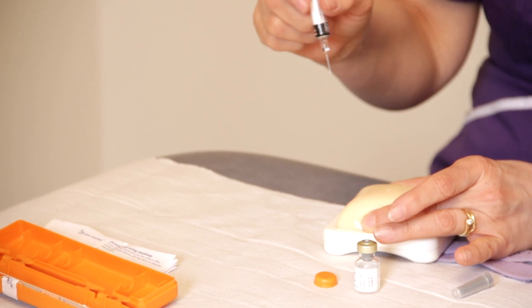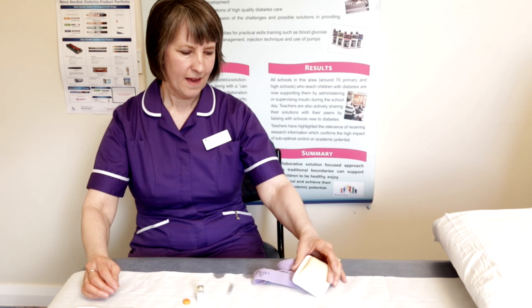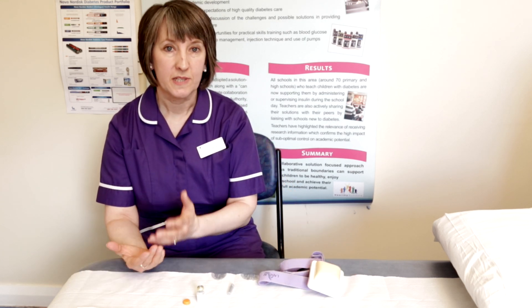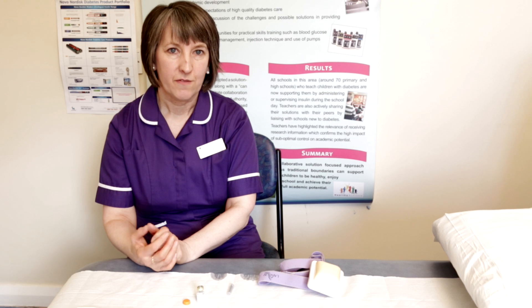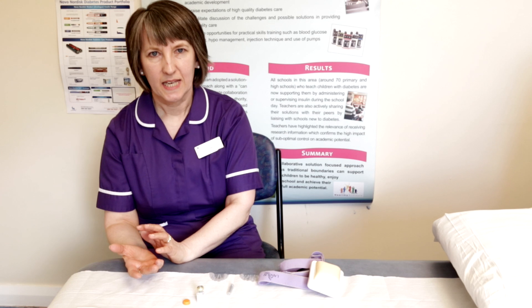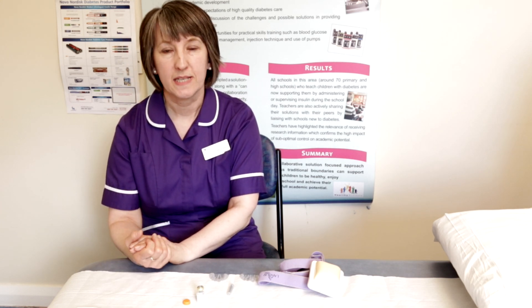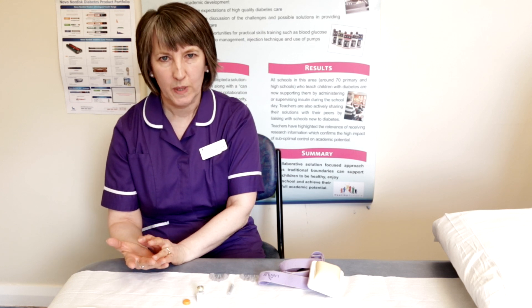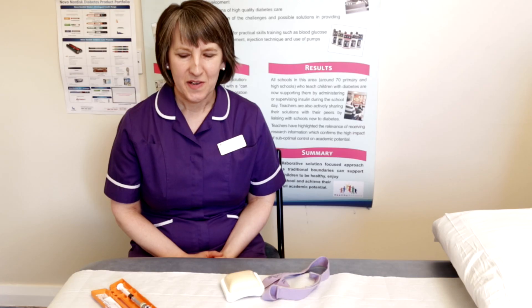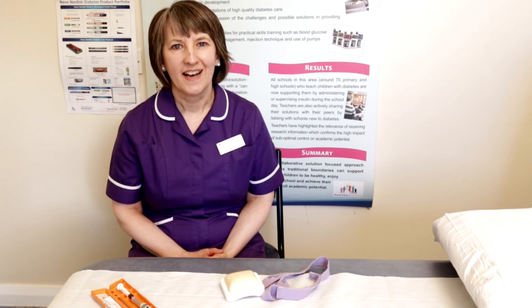Take the needle out and dispose of your syringe in a sharps box. Then put your child in the recovery position and wait for the ambulance and help to arrive. This medicine can make you feel a little bit sick, so it's probably a good idea to wait about 20 or 30 minutes before you offer a drink or something to eat. By this time the ambulance crew should have arrived and your child should be recovering. So that's how you give an injection of glucagon — I hope you found it helpful and thank you for listening.